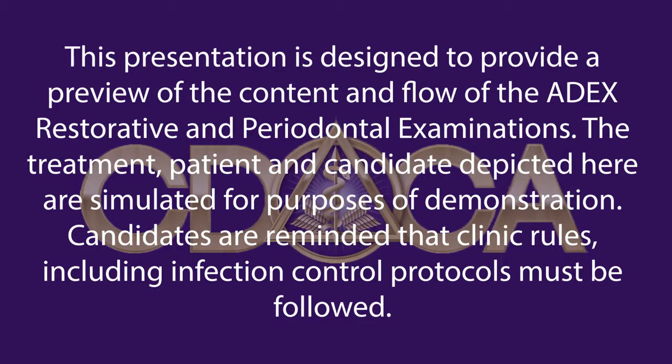This presentation is designed to provide a preview of the content and flow of the ADEX Restorative and Periodontal Examinations. The treatment, patient, and candidate depicted here are simulated for purposes of demonstration. Candidates are reminded that clinic rules, including infection control protocols, must be followed.